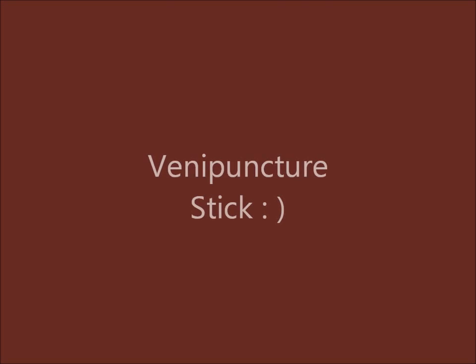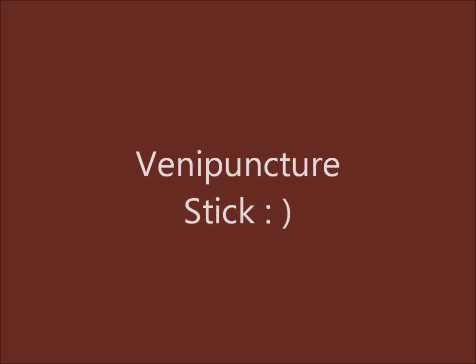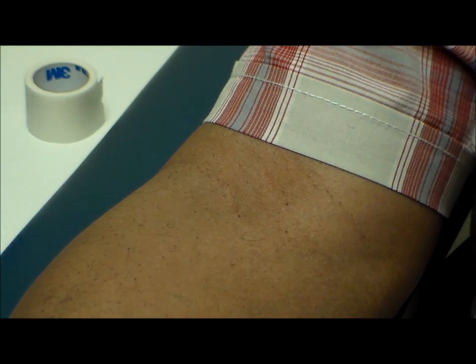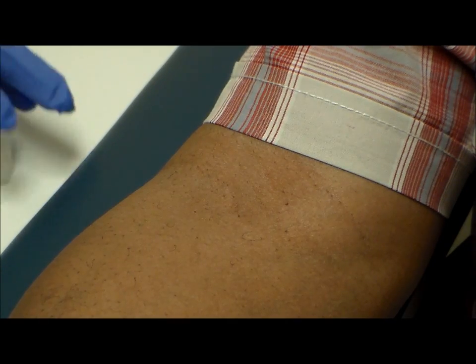Hey guys, so I am going to do another venipuncture for you guys at a slower pace than I did the first one. The first one, like I said, I was rushed and I just wanted to get something out there for you all to see how I pretty much operate. This one is a little slower, but I can only go so slow because when you are so used to doing it, you just do it.